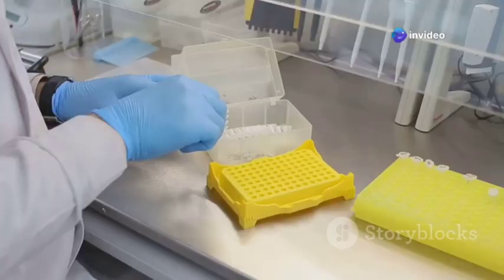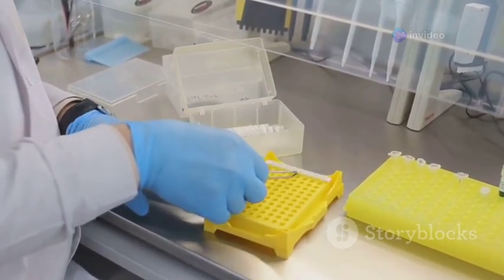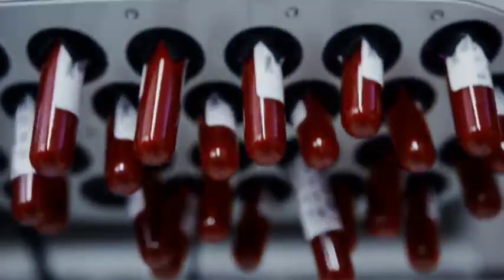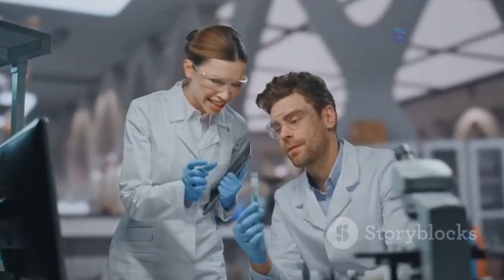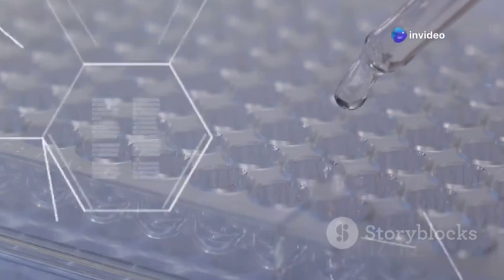Hey there, science fans. Today we're diving into the world of ELISA, a powerful tool that helps us diagnose infections. ELISA stands for Enzyme-Linked Immunosorbent Assay. It's a mouthful, I know, but don't worry, it's not as complicated as it sounds. Think of ELISA as a tiny detective in the lab. It helps us uncover clues about infections by detecting antibodies in our blood.